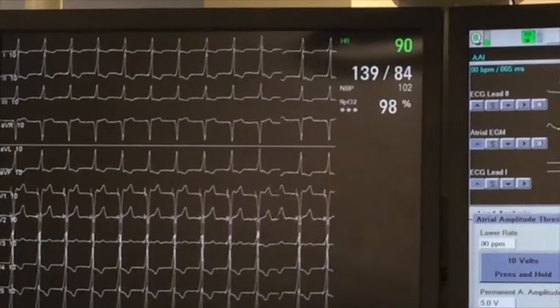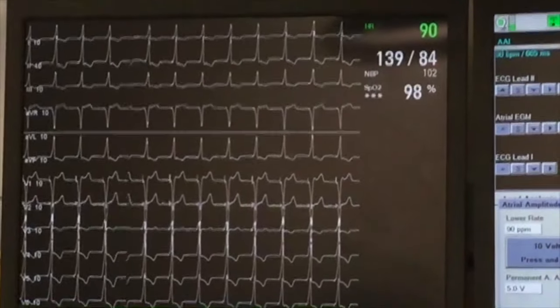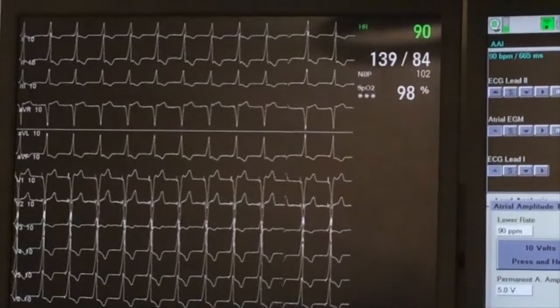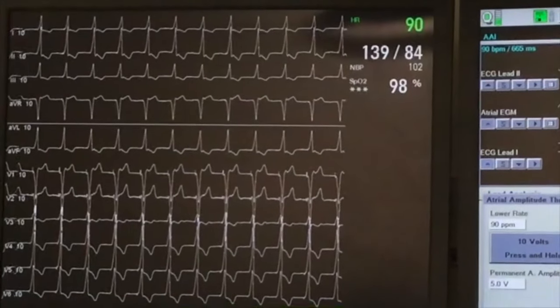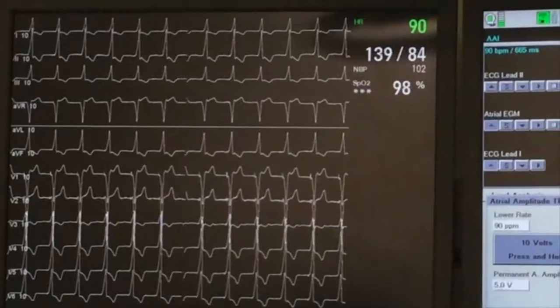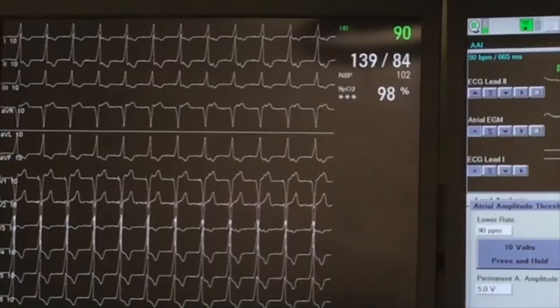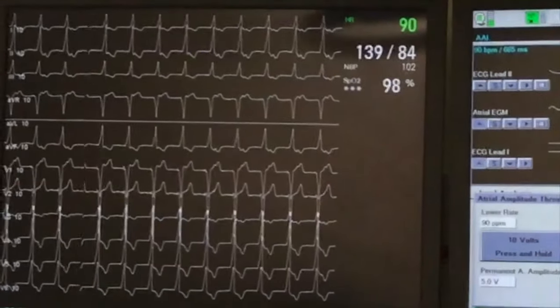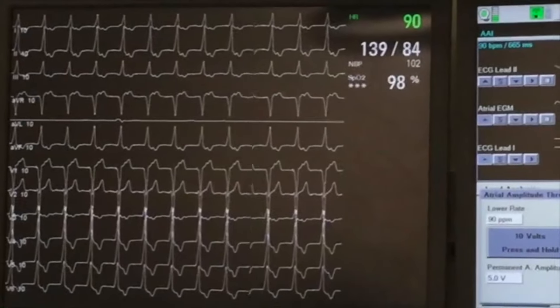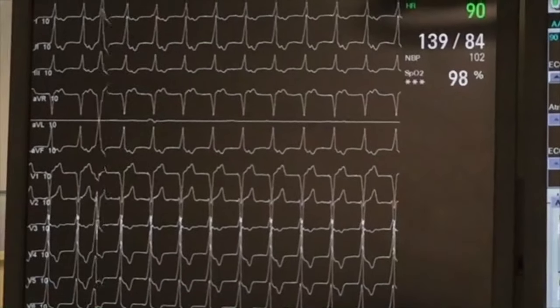As pacing output is reduced further, the QRS width has not changed much. However, at very low pacing outputs, the retrograde P wave shoots out, separating itself from the QRS, thereby demonstrating a longer VA interval. This can add a nice physiological confirmation that the his-bundle is in fact being recruited and that there is retrograde conduction up the his-bundle into the atrium.